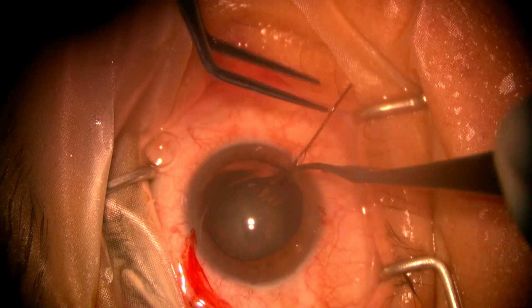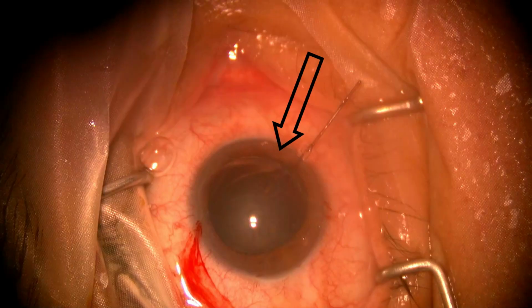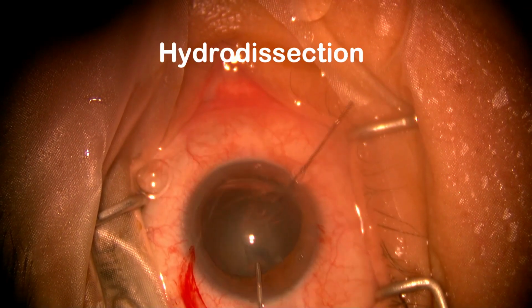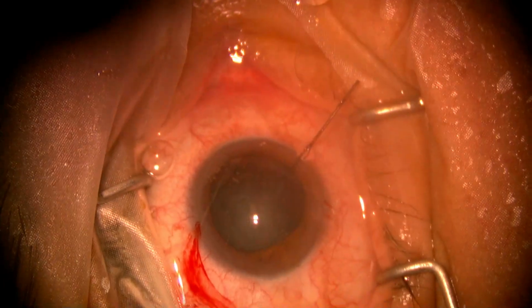We can observe the gap of subluxation before and after the application of the capsular tension hook. Limited hydrodissection is being done in this case of traumatic cataract.